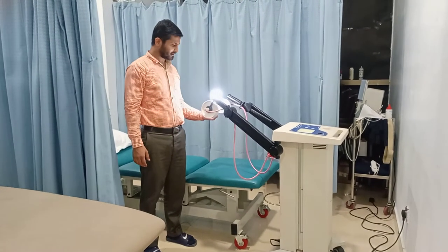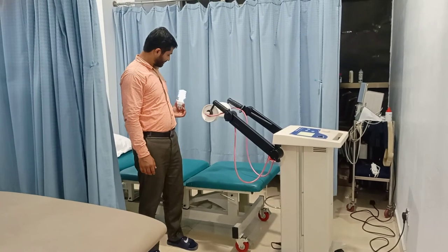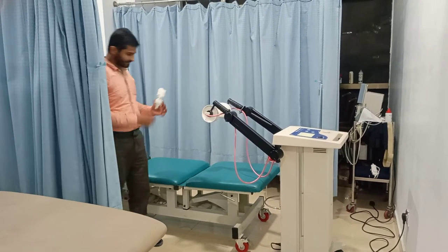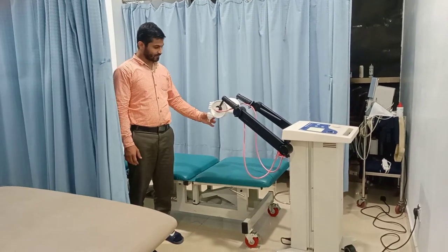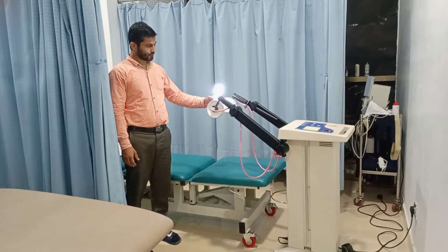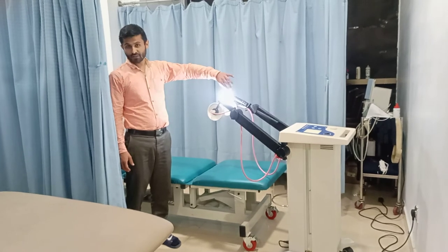Here you can see that this is glowing. Look at this — now there is no light, and I hope you can see clearly that it is working.